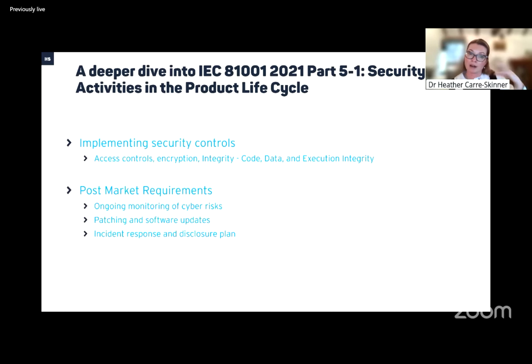Identifying is one thing. It's also implementing them as well. So these are also built into requirements for your device. So looking at topics such as access controls. So how does the user log into the device? Is it 2FA? Those sorts of things.